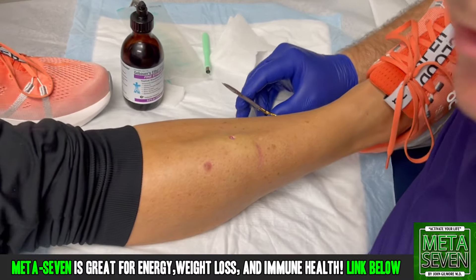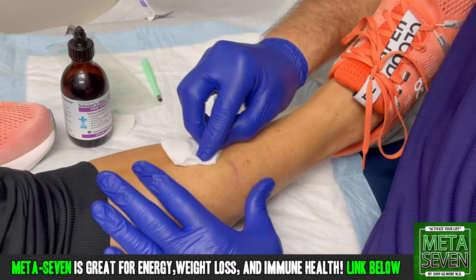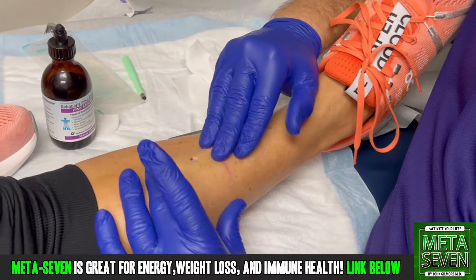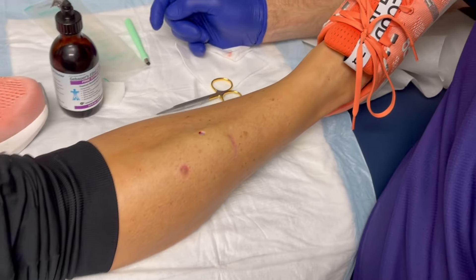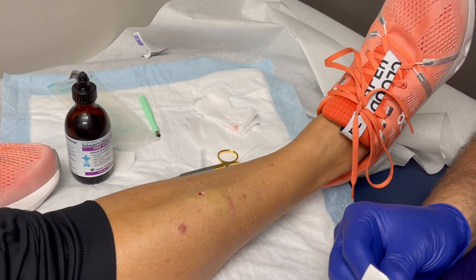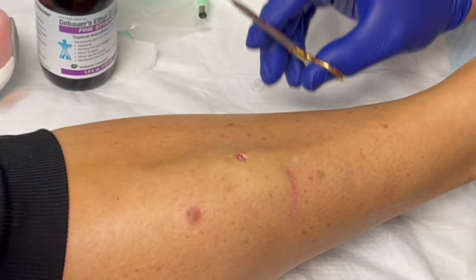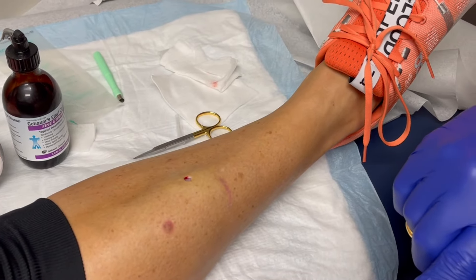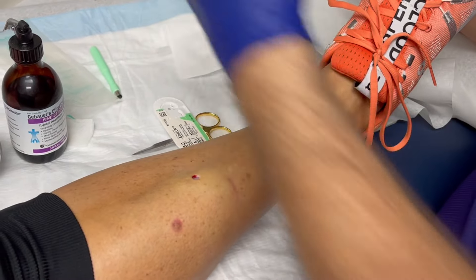And it's gone. This is what you're left with — the lesion is completely removed. All we have to do is put a stitch in there. Pretty quick, right? No pain. We hadn't done a video in a little while — we've been busy.